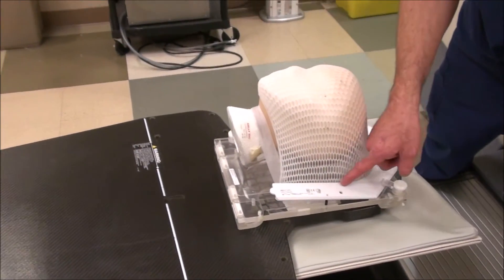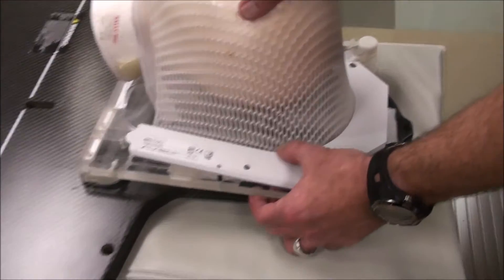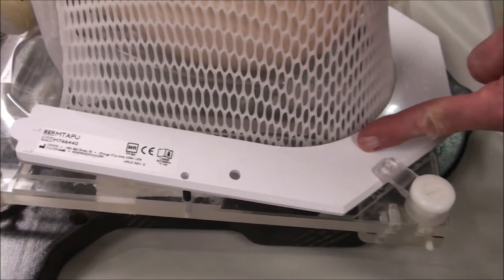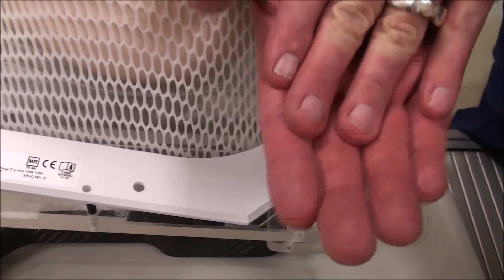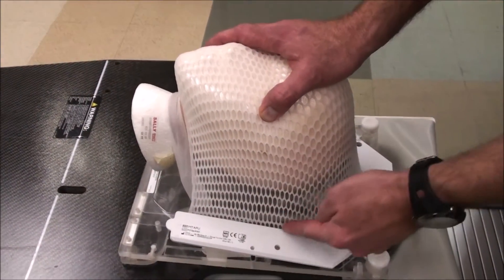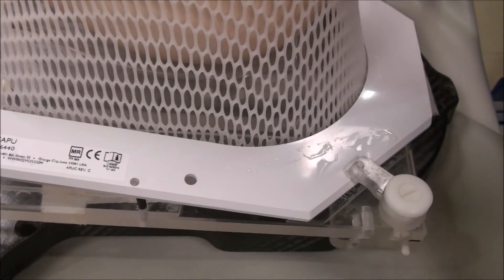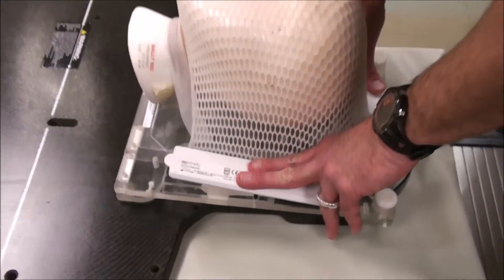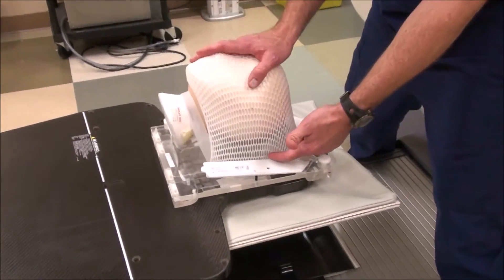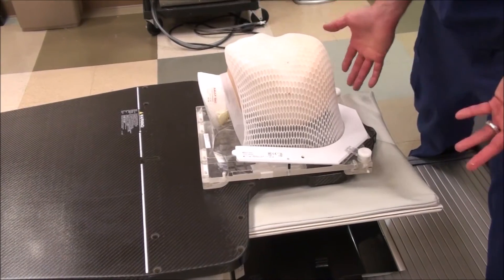In this particular case, the last thing you're going to do is look to see if it's set up. You're going to kind of push right here — you can see how it's still stretching. This mask is going to hold the heat along the base where it is glued to this plastic. Out in air, it's going to dry very quickly. There's no stretch right here, but you can see there's still a little stretch — that's an indicator that you don't need to take this mask off this person yet. This needs to stay on the person for another three to five minutes. When you can push and you don't have give because of the heat held by the base, then you're pretty much done.